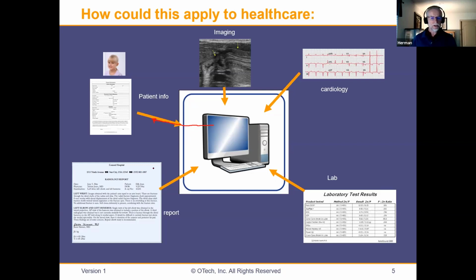The same thing with reports and document management system, single source. My cardiology, my EKGs, and my cardiology information system, my lab and my laboratory information system. And last but not least, imaging, let's say in the VNA, right? Enterprise Archive, where it's central, right? Some countries like Canada have it, the VNA is on the province-based, right? So they have all of these images in a central location. I simply have a DICOMweb URL that provides me that image.